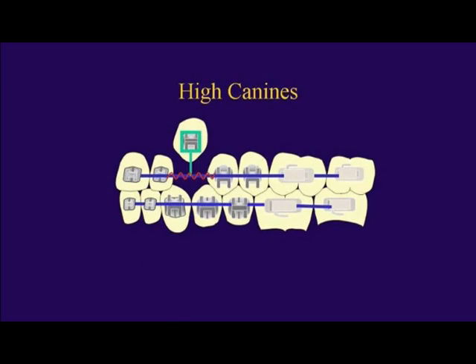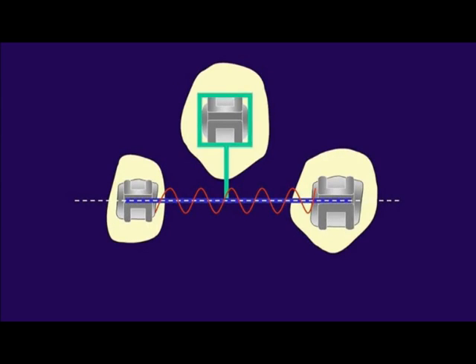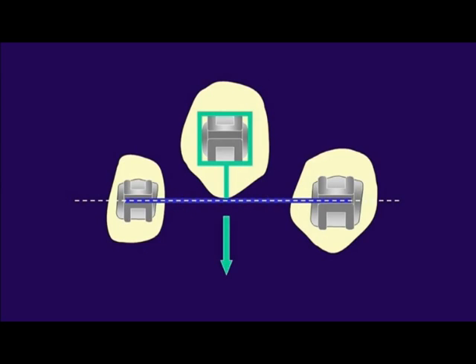This is a more appropriate way to go after these high canines. You want to use a wire that bypasses the canine itself and then go after the canine from the arch wire to the tooth itself. If you use an elastic to go from the canine down to the arch wire without bending that arch wire up directly to the canine, you're going to get a much more predictable tooth movement. It'll actually be faster because you're going to avoid those unwanted side effects of the adjacent teeth. It's going to help bring that tooth more straight down without getting tipping, intrusion, and rotation of the adjacent teeth.